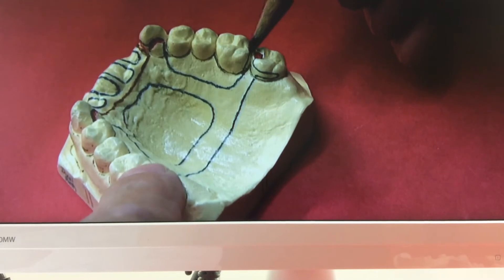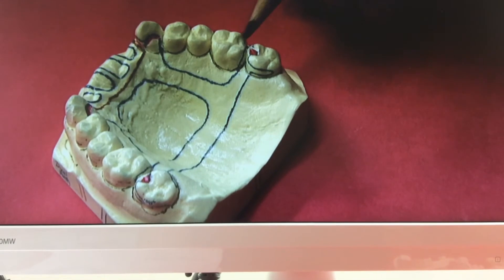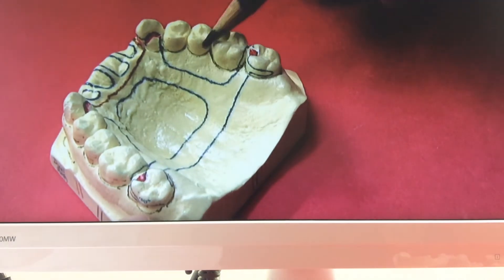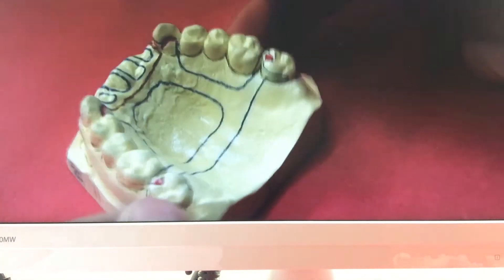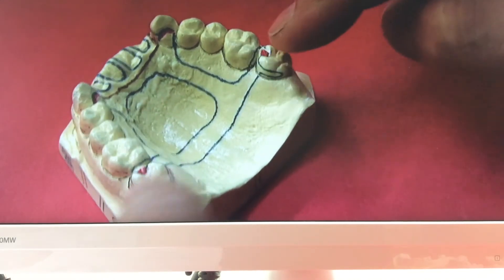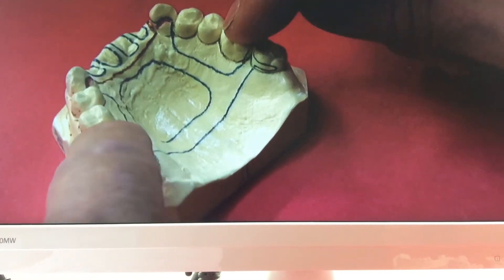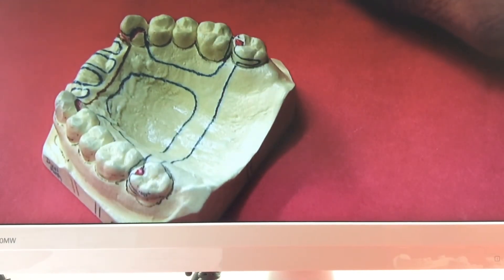Then I'd drop back with the same posterior design, and in the posterior region I would do an embrasure clasp. I'd have a mesial and distal rest, two reciprocating arms on the lingual, and two retentive arms on each side on the buccal — picking up additional retention by sharing the load across two teeth with an embrasure clasp.